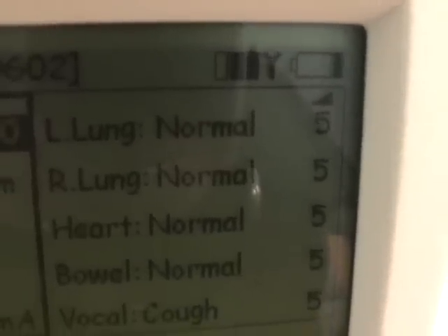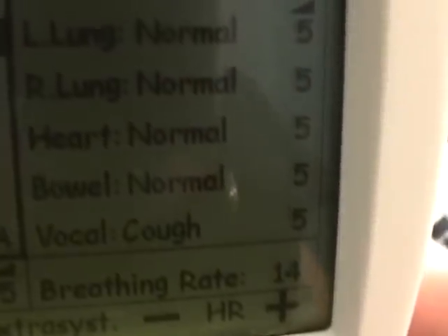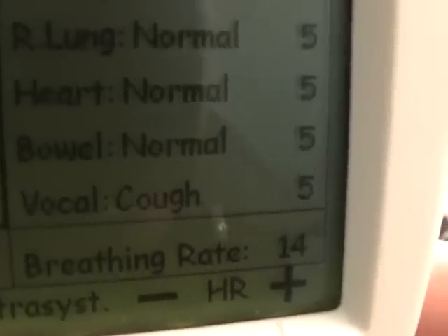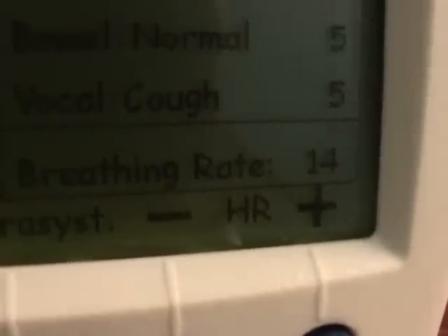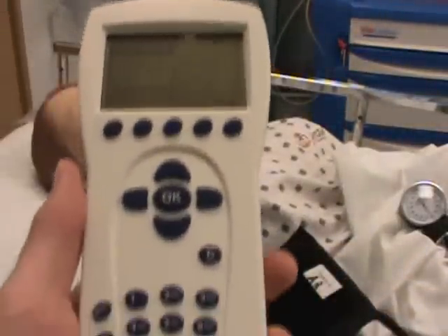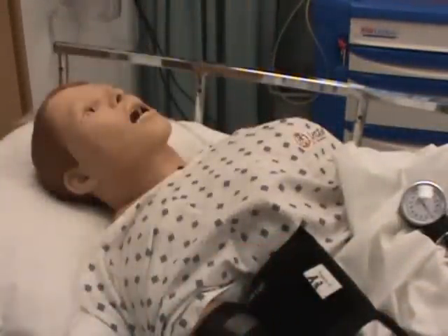You'll also see a normal heart rate at a volume of 5, regular bowel sounds at a volume of 5, and a breathing rate of 14. Those are your default settings. Our subsequent videos will show you how to program the handheld device to change those settings.